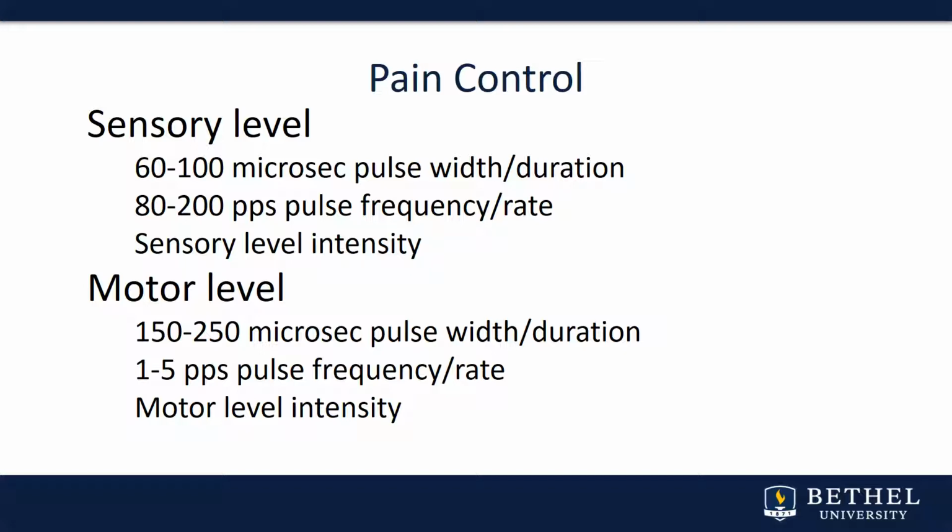This is a great set of parameters for introduction to electric stim if the patient hasn't ever experienced it before. And it's kind of the first level of trying to decrease pain with electric stim. You need to memorize these parameters and make sure that you remember which units go with which numbers.